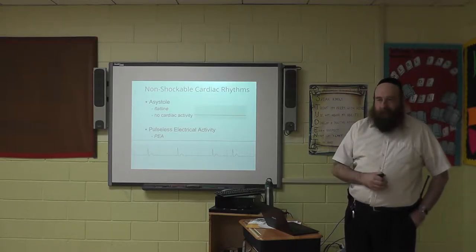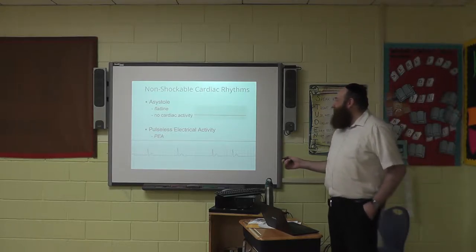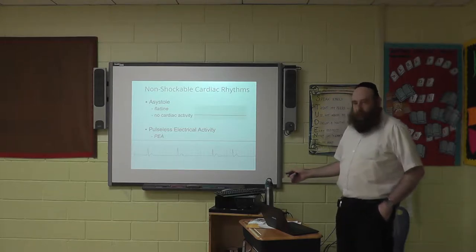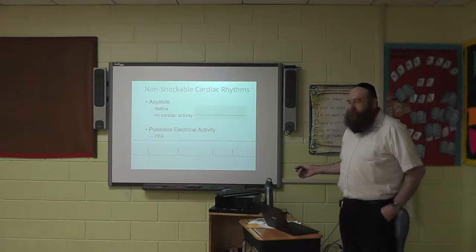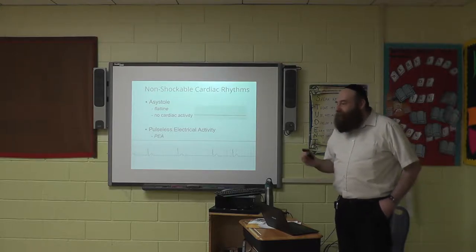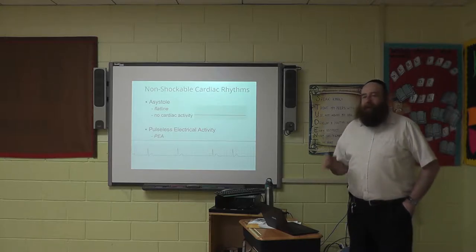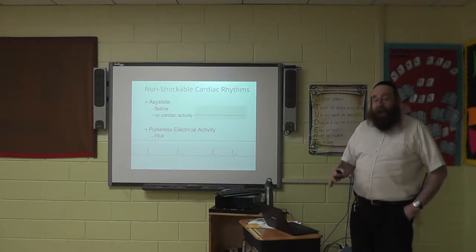Very good. Pulseless electrical activity. It gives a rhythm as if the person is alive, but it doesn't know if there's a pulse or not. The monitor can't feel a pulse. It only reads electrical activity. So there is one rhythm called PEA, pulseless electrical activity.